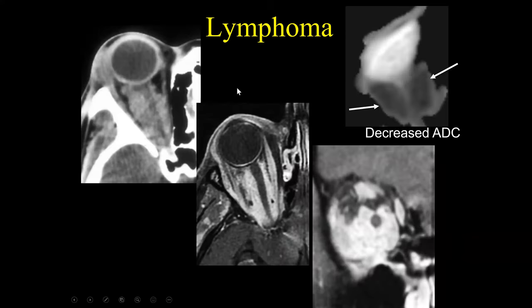This is an example of lymphoma involving the orbits and the optic nerve. Lymphoma tends to be a little bit more advanced when it presents and can be relatively bulky. Notice the bulkiness of this enhancement — it has more of a softer appearance and is not really compressing the optic nerve, but rather has diffuse enhancement and a more bulky appearance. This is the classical appearance of lymphoma.